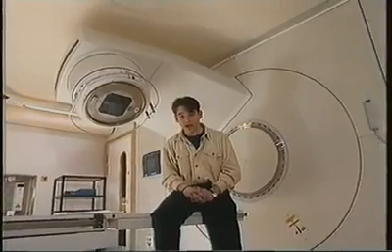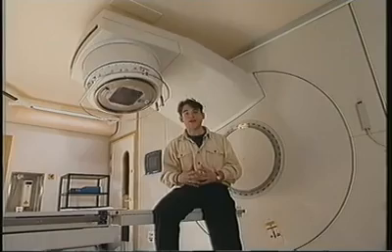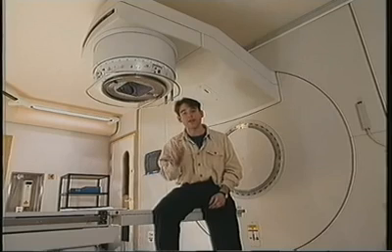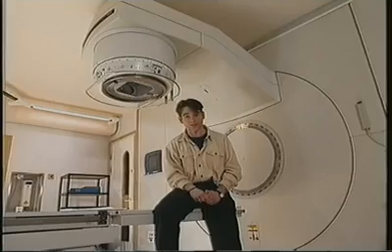Cobalt-60 sources are widely used by radiotherapists, but increasingly they're using machines like this one, a linear accelerator. Now, linear accelerators have a big advantage, and that is that they produce X-rays of a much higher energy, and so therefore they can be used to treat tumours that are deeper within the body. The X-rays are generated electrically, and they're under computer control, so this means that the edges of the radiation beam are much sharper. This can be very important when treating areas close to critical organs.